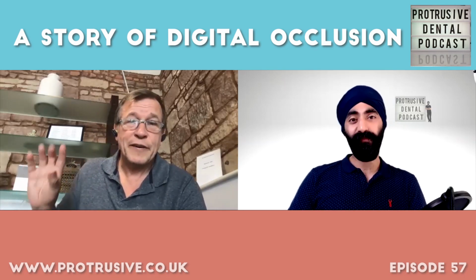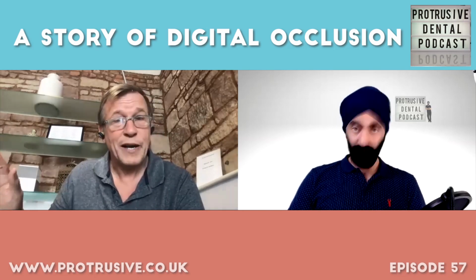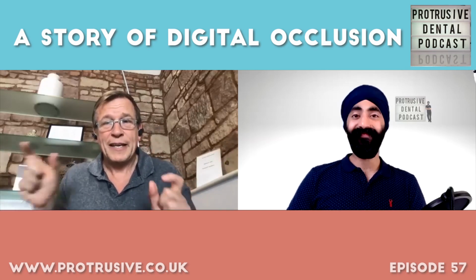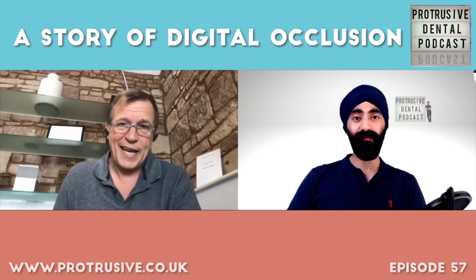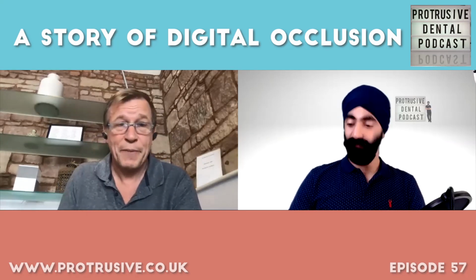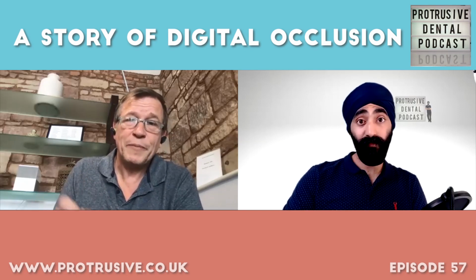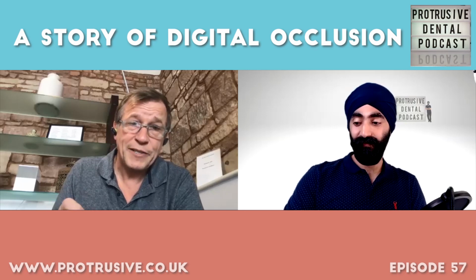So there's a difference between that and a proper, fully functional diagnostic wax-up. But there's a big gap between patient and fully functional diagnostic wax-up. This additive mock-up can be the link, I think. Well, I know it is. It certainly is in my hands and in my practice, because we can do those. And I'm working with some of the labs right now. You're going to be seeing some things pretty soon where we can do those inexpensively.